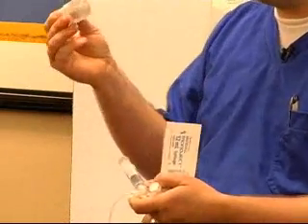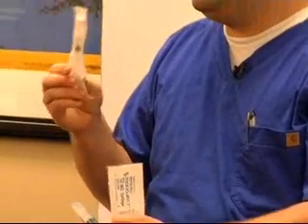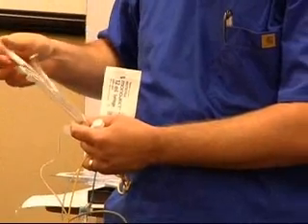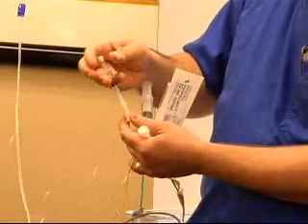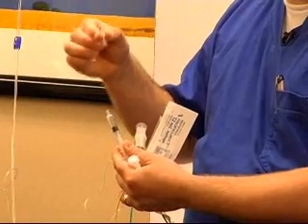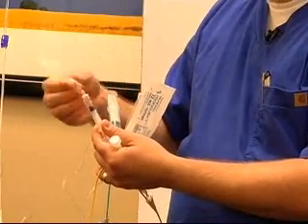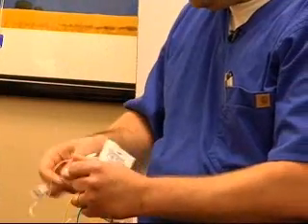Now this is a heparinized syringe. We have a couple different ones, but this is just an example of one. The reason you're using a heparinized syringe is because you don't want it to start clotting, of course, whenever they go to run it as a mixed venous. A couple things on that syringe, whichever one you use, usually they come with the same basic principles. There's this little cap. Why do you have that? Once you're done with the sample, you need to put this on and put blood up into the cap. That makes sure you don't get air trapped in your sample, which can cause skewed numbers, okay? So we'll put the air out of this heparinized syringe. We've already drawn our waste.